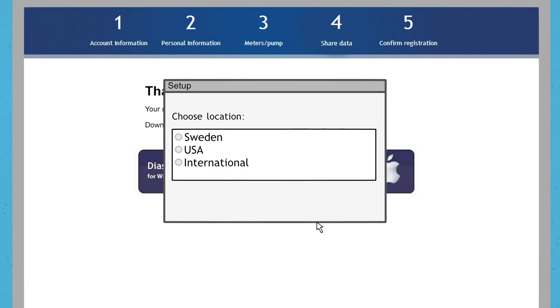In the setup stage, please be mindful to select the right location depending on which country you live in when installing Diacend Uploader. All U.S. patients should select the U.S., Swedish patients should select Sweden, and patients in any other country should select International.